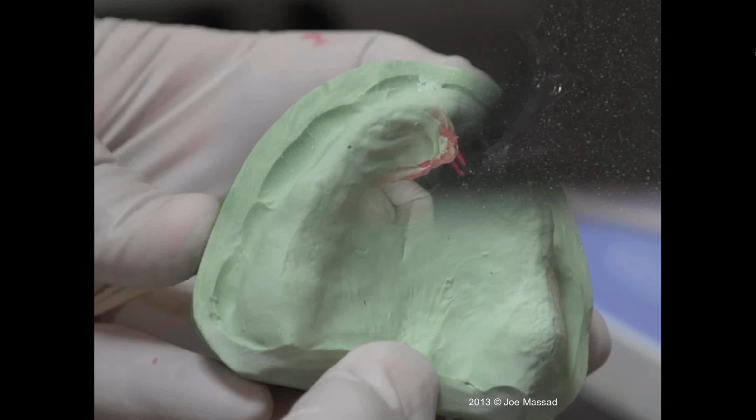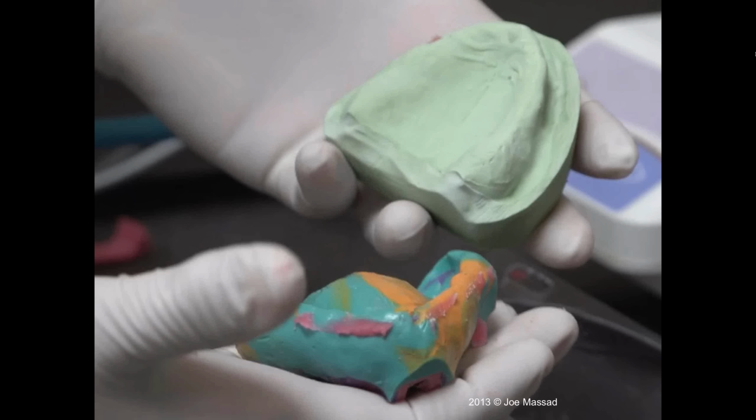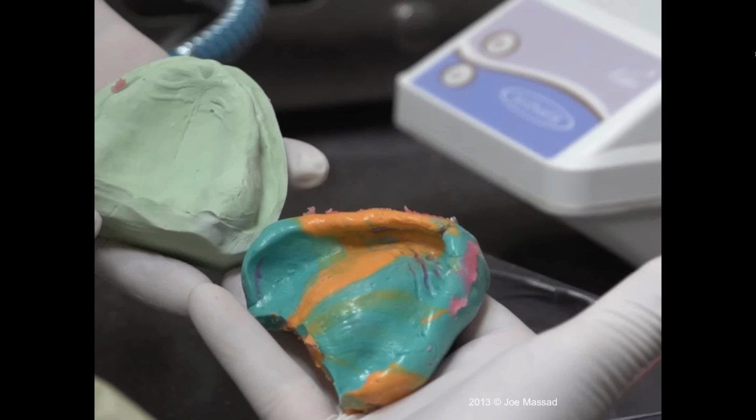And if you do it very accurately, you can bounce from a hygiene patient, for example, then go over and have your assistant or yourself make your base, get this completed, and the patient maybe just had a relaxful cup of coffee or something, and then you go in and make your records. It's been very efficient in our office utilizing liquid material. I've been doing this for several years.